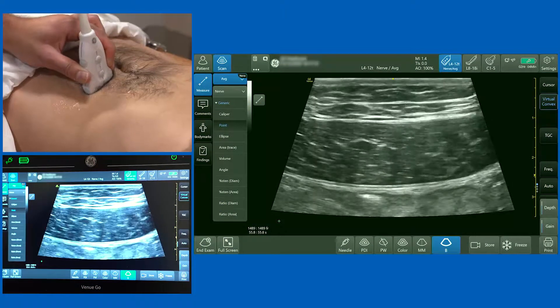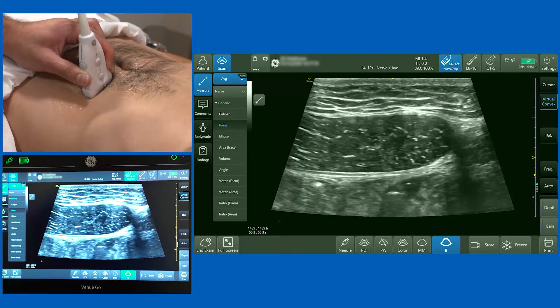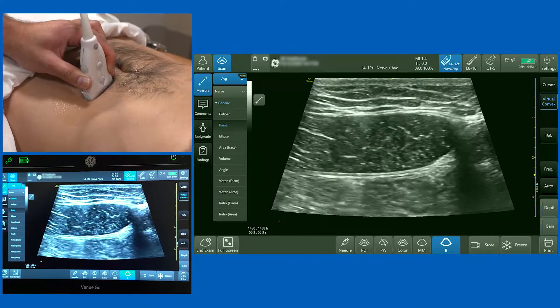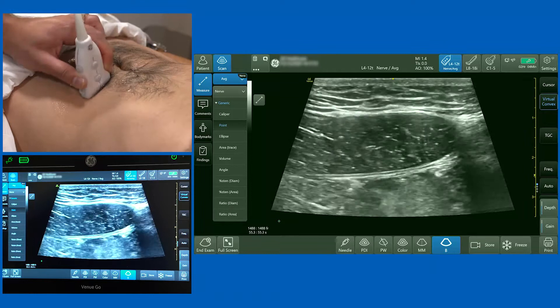Next we're going to scan for the rectus sheath block, which is a really useful block for midline abdominal analgesia. I'm using a high-frequency linear probe and I've opted to put on the virtual convex mode in order to give us the best field of view. The right-hand side of the screen is lateral, the left-hand side is medial.